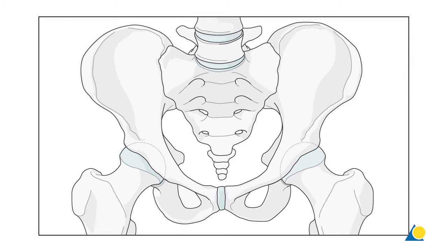Access. This is a percutaneous technique, so access is determined by C-arm visualization. The preoperative X-rays and CT scan are reviewed to determine the size of the upper sacral segment corridor and if the sacrum is dysmorphic. The posterior pelvis must be well visualized in all views. If it is not, the percutaneous insertion of screws is not feasible.